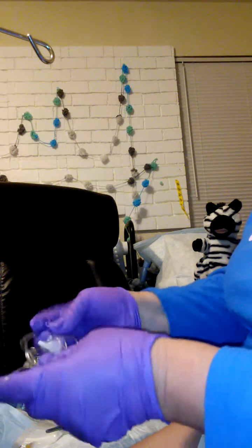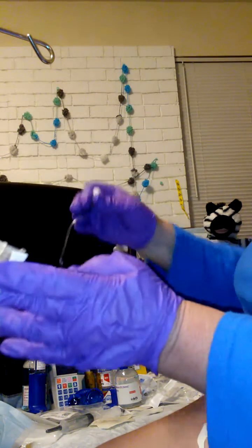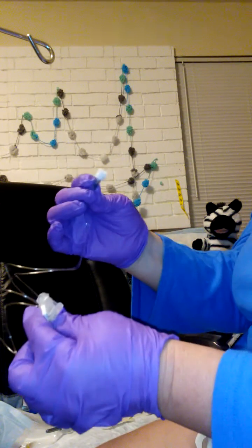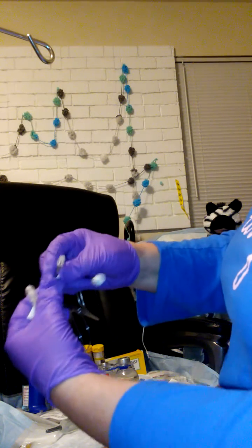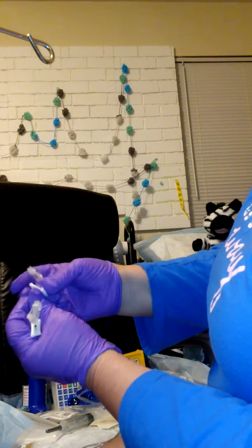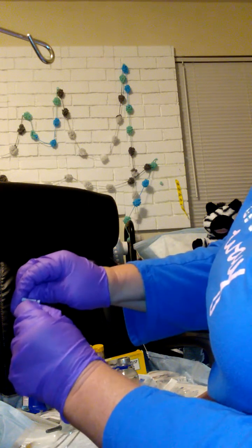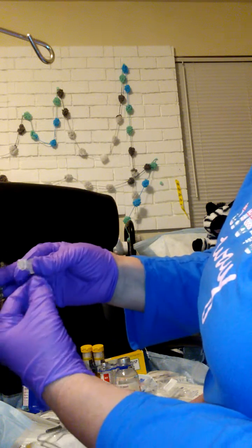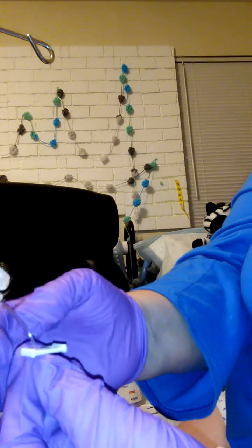Okay, untangle this little part here. This is going to hook up to the syringe that I just put all the medicine in. But before doing that, I am going to put a lock on this. Yes, I'm going to put this little lock down here so that I can dry prime those needles. One thing you do not want is to have the medicine come all the way up into this and come out the needle, which is secured right here.